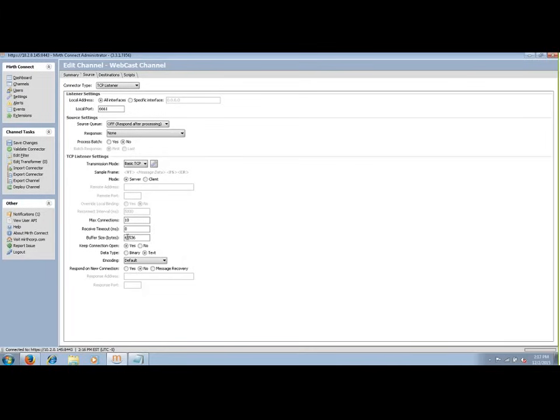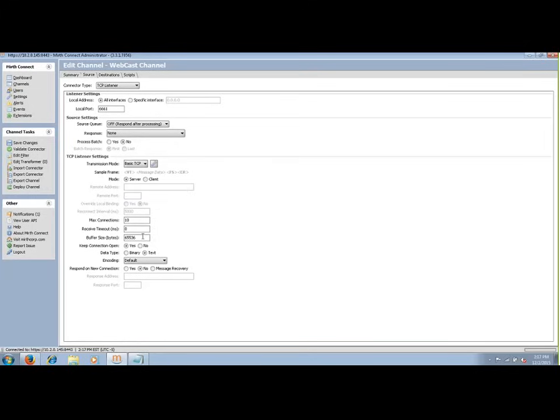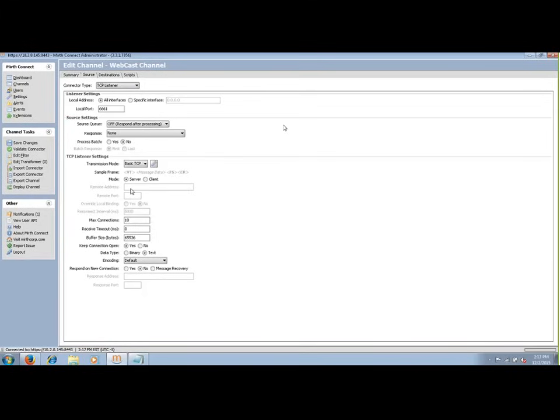Within the source tab there are a lot of connection-specific settings. Here we chose a TCP listener set to a mode of server, meaning it's waiting to accept messages. You can set buffer size and keep-alive. If we were to set it for a database reader, this is where we'd define our connection parameters to that database.